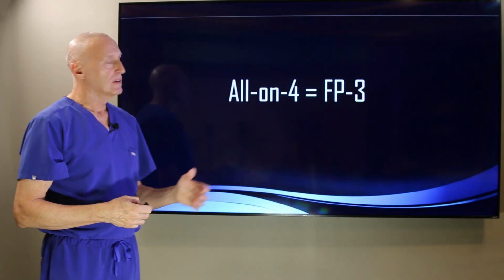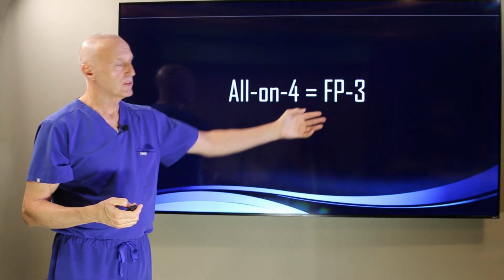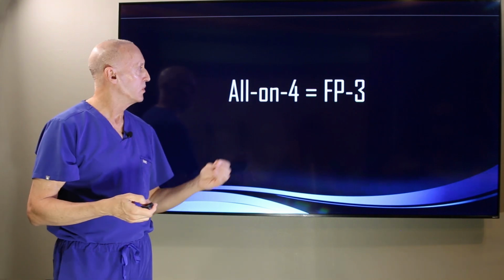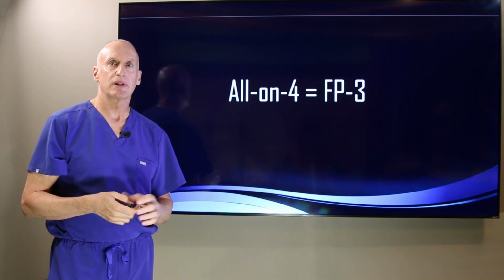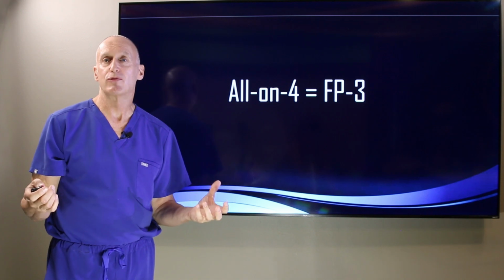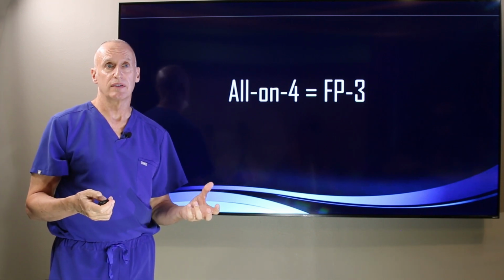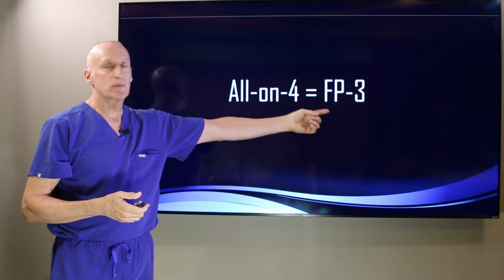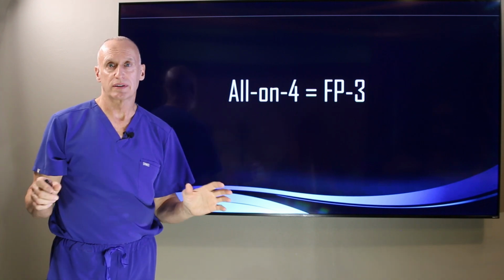Then we move on to all-on-4, which is FP3. This is all that's offered in the all-on-4 practices. So if they try to tell you that it's an implant bridge, I'll bet you we have four other videos out there that talk about the differences. But all-on-4 equals FP3 all the time.